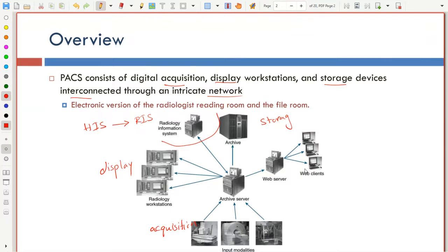So sometimes you have general radiologists who can diagnose the simple cases, but if you have a very specialized case, if you really need a specialist or a consultant, then you might send the data through a web server to a consultant in a major hospital somewhere else, and use his expertise to diagnose the case and send the report back to that small hospital. So you might have a connection to a web server that would allow doctors to be working from remote areas, from remote sites.